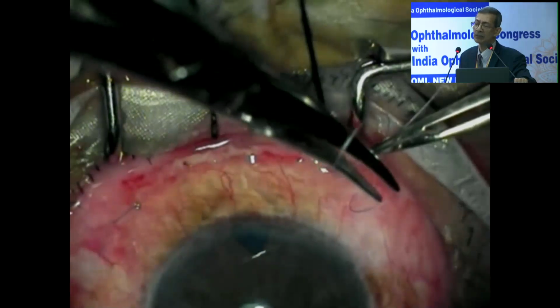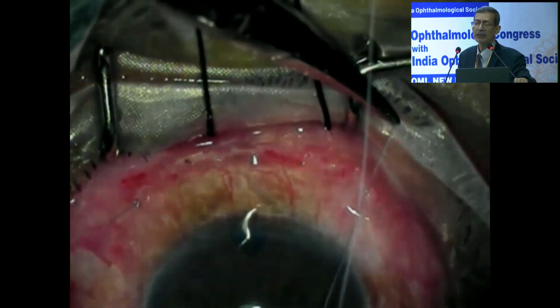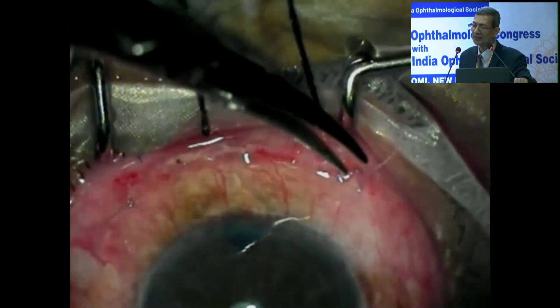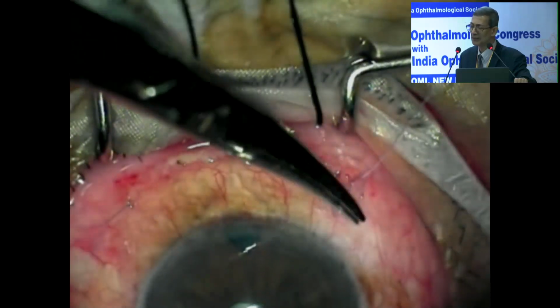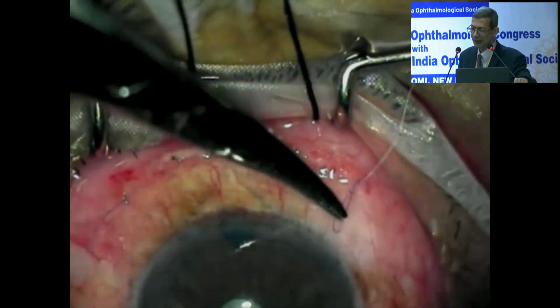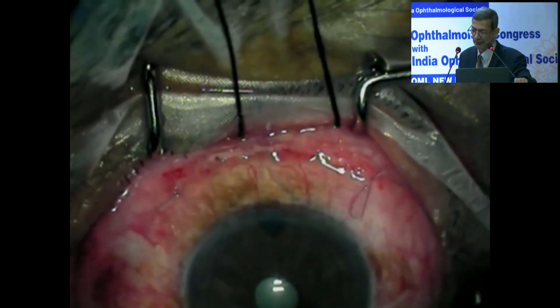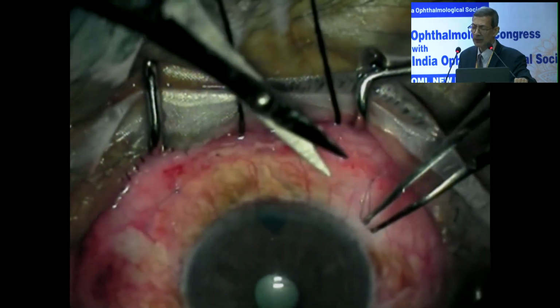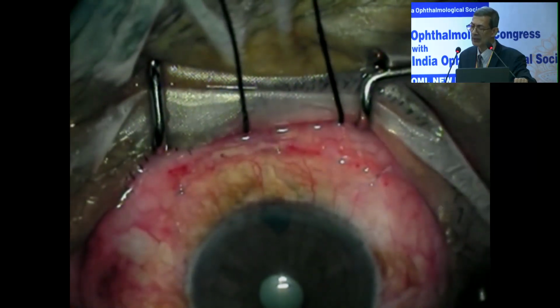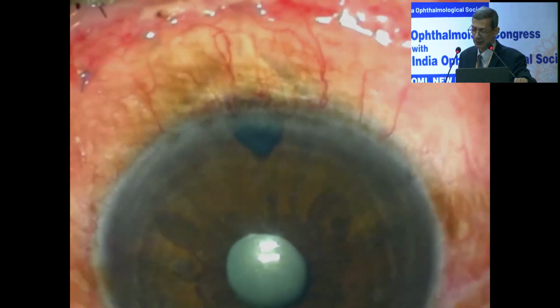I personally believe in minimal invasion or minimal manipulation, because in Indian eyes the iris pigmentation is such that the moment you try to see the efficacy of the ostium, how it is filtering intraoperatively, it will lead to release of pigments, etc., which will cause more inflammation in the early postoperative period. With the least manipulation, except the iridectomy and the final stage of trabeculectomy, I have not entered the anterior chamber, and this is the standard appearance at the end of surgery.